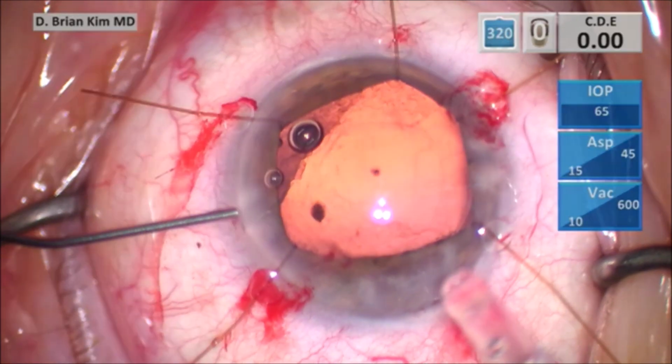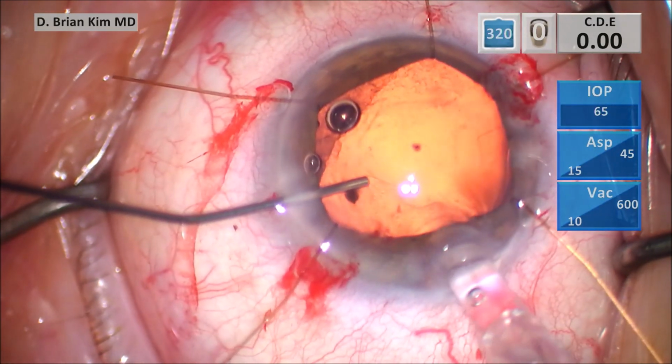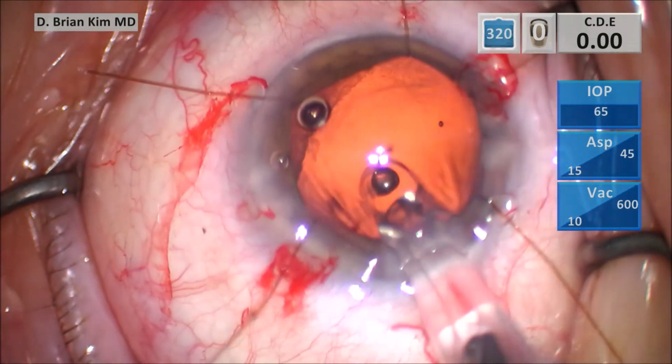So again, if you look real closely, this is what the anterior capsule looks like. Essentially, it looks like a keyhole. So this is the single piece acrylic lens. Go ahead and place it through the incision, pushing some more cohesive viscoelastic to fill the bag, placing the lens within the capsular bag.